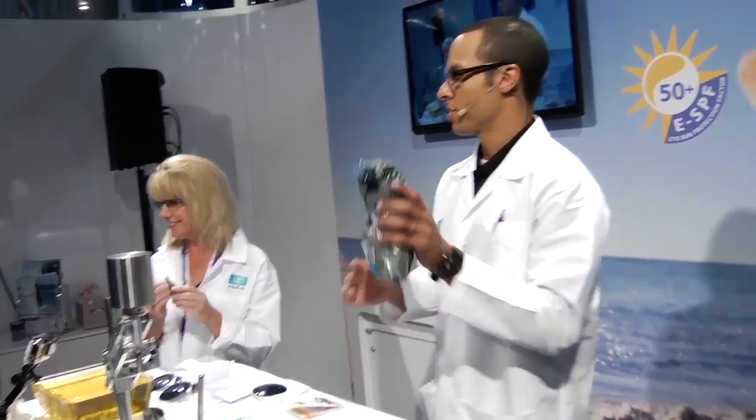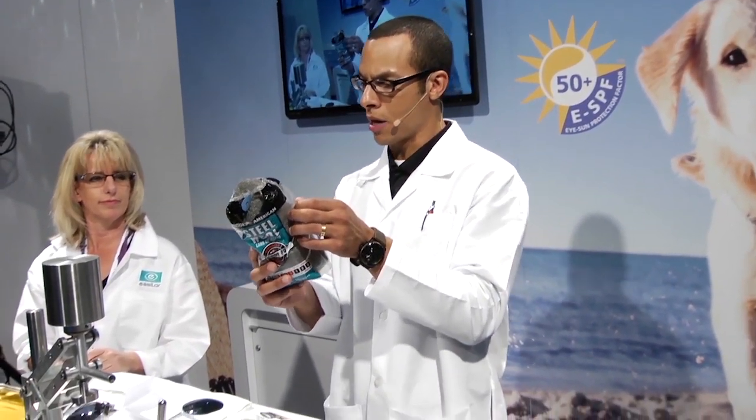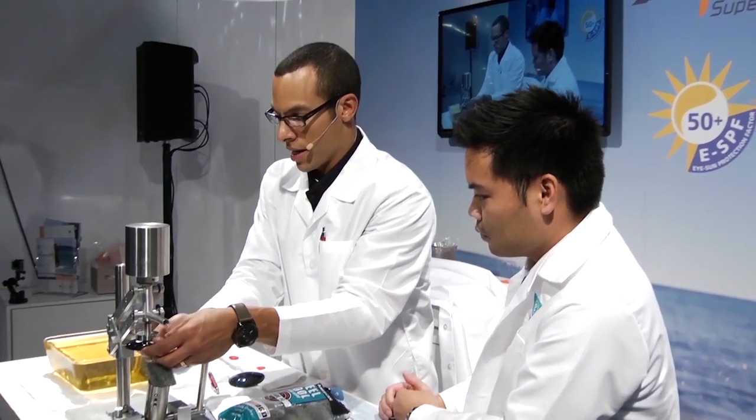First thing we're going to do is put this weight on here. This thing is 6.6 pounds of steel wool. In fact, on here it says: scour pots, pans, utensils, metal surfaces. It does not say rub this on your lenses. Put this right in here like so.